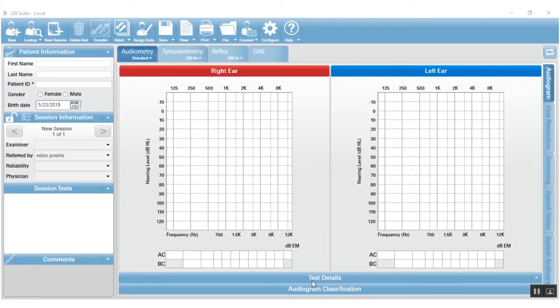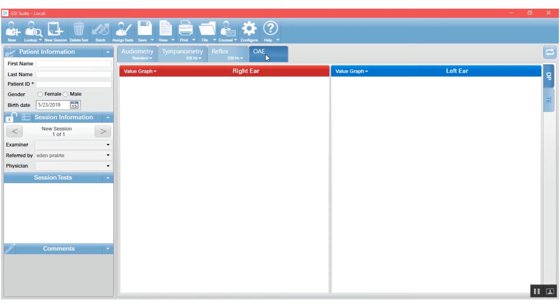When you're transferring data from the GSI Corti into the GSI Suite, it's a little bit different than transferring from an audiometer or a tympanometer. The first thing you will do is go to the OAE tab to activate the otoacoustic emissions.